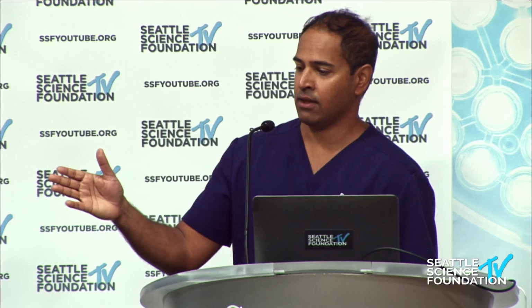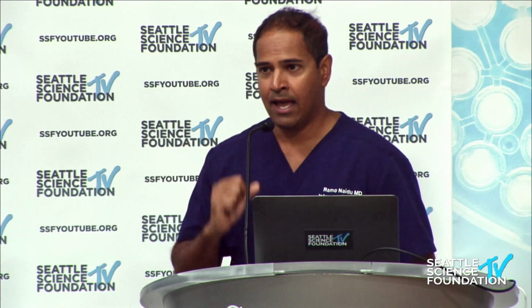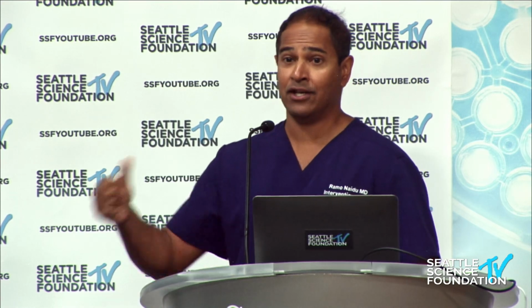If I have an indication that works between the two, DRG stimulation generally gets you to that high responder rate, at least an 80% reduction in pain, whereas PNS may work, but it may have a lower threshold, like 50%. So between the two, I'm going to go with DRG. But the challenge is when you're talking to a patient who had a knee arthroplasty and has severe pain from that, and you tell them, hey, I can put these wires in your spine versus I can put these wires next to your knee. They just had a surgery that screwed them up. They don't want you doing a surgery on their back because they're worried that that's going to get screwed up too. So I find a lot of patients are more interested in PNS because it makes more sense to them.